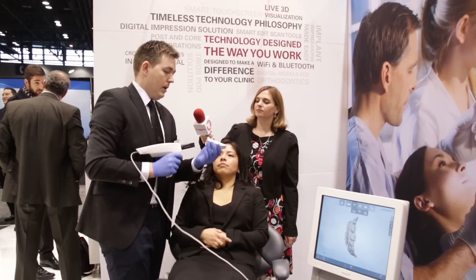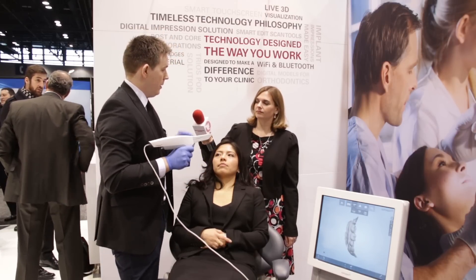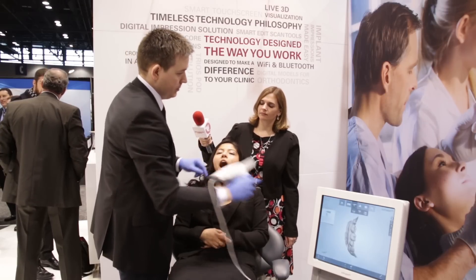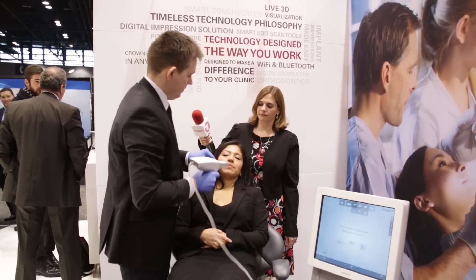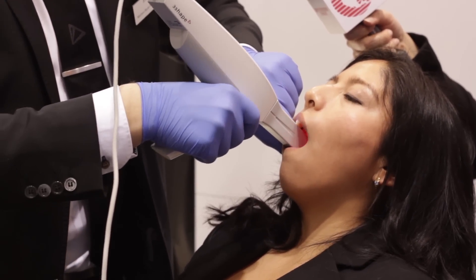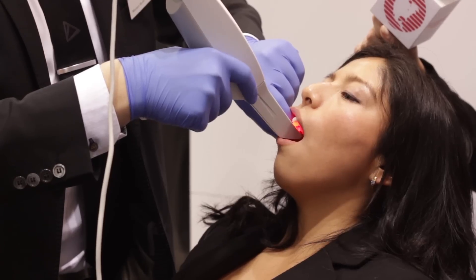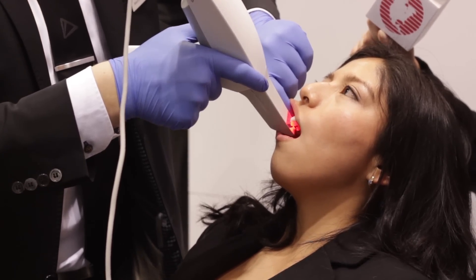For the upper jaw I'm just going to snap on and move it around 180 degrees and now I'm ready for upper scanning. The lower was about 20 seconds and the upper is probably about the same.